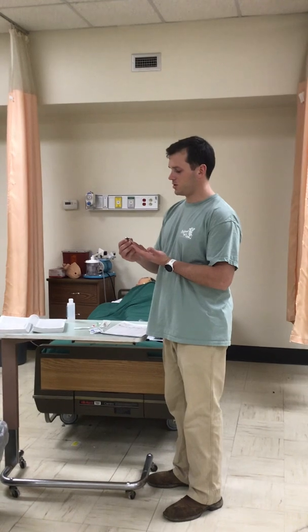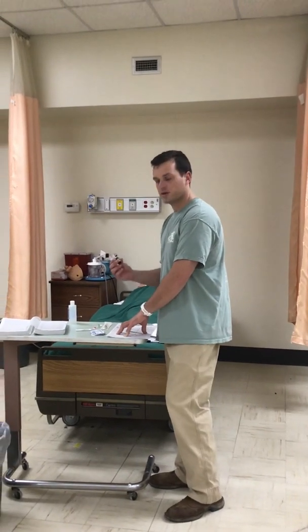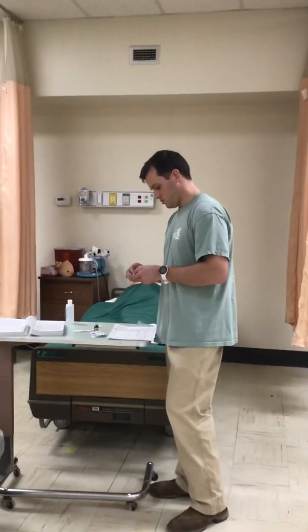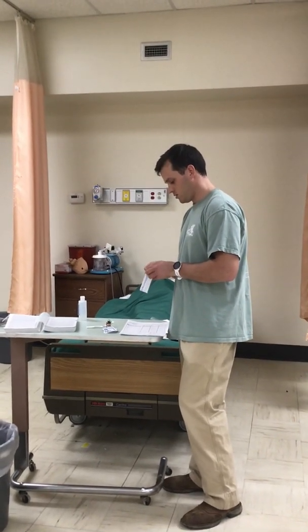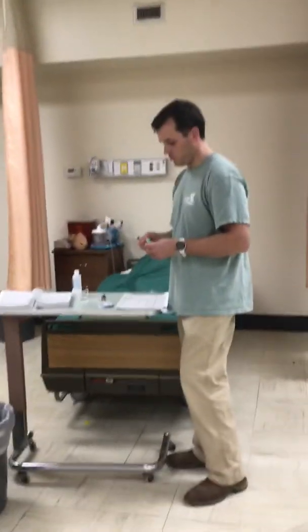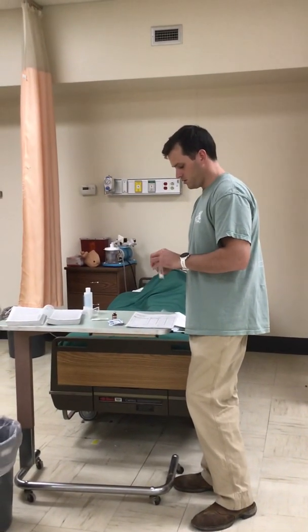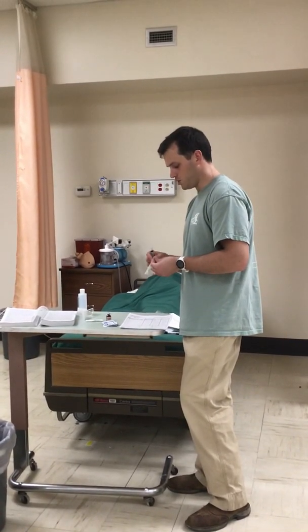And I'm also checking to make sure it is furosemide, which does match my MAR. So this is the second time I'll be checking to make sure that I'm giving the right medication to the right patient. Again, it is 10 milligrams per milliliter. So in this case, I will be pulling up 3 milliliters to administer, and that will be 3 milliliters over 2 minutes that I'll be giving IV push.